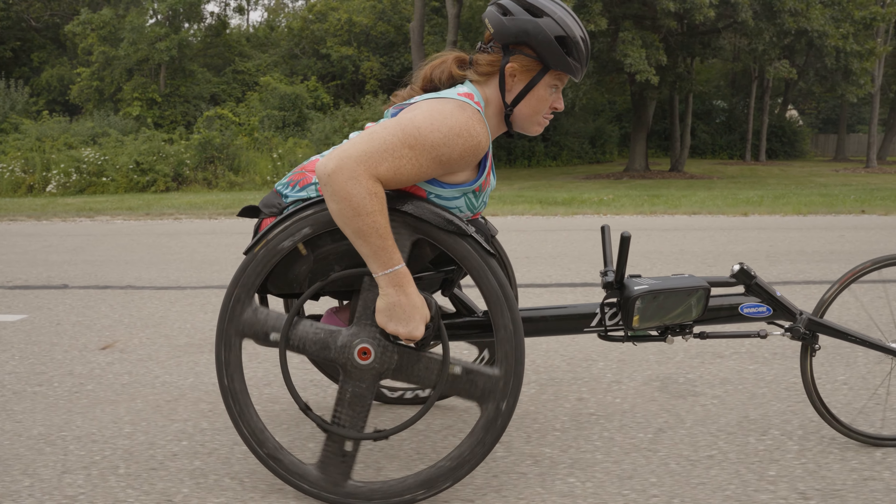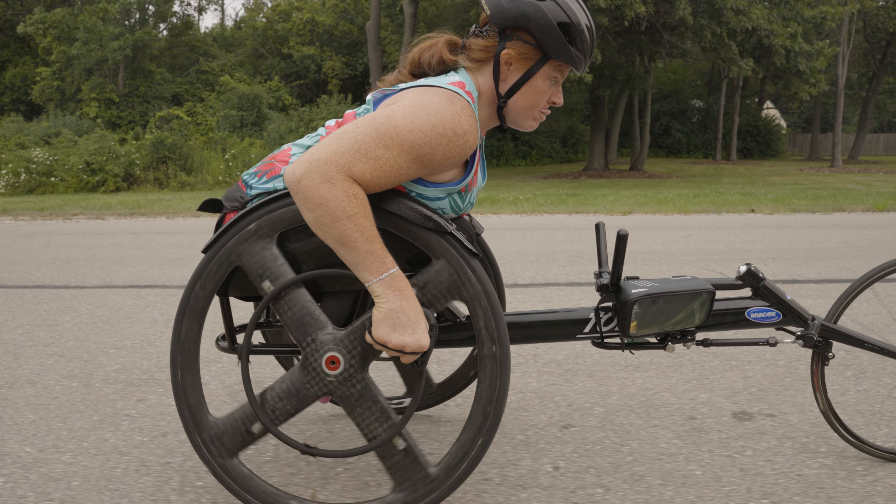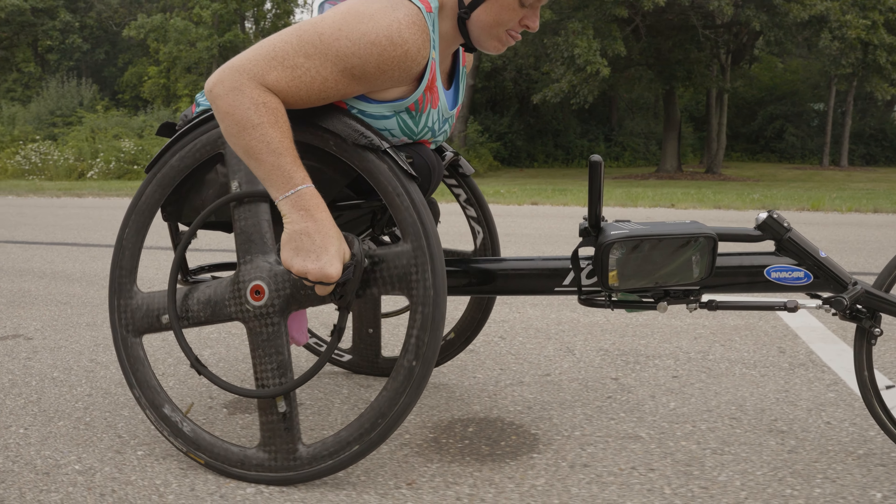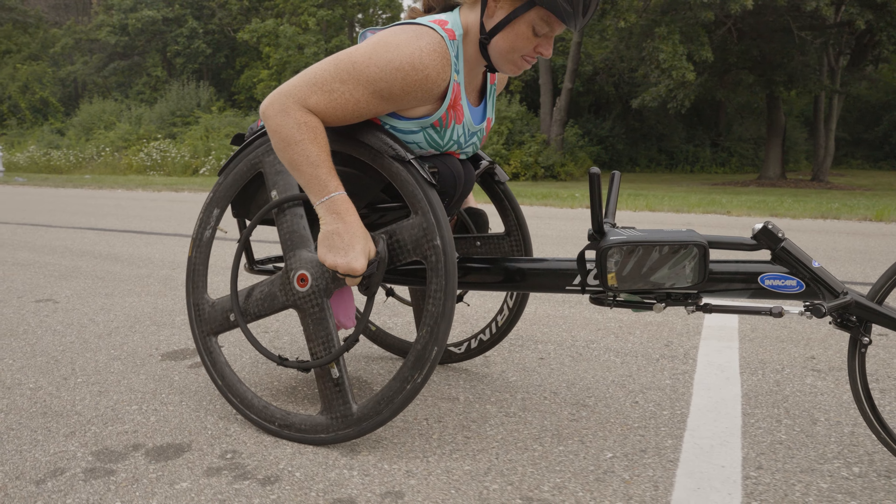To stop your racing chair, practice your deceleration process. I recommend using your wheelchair racing gloves to apply pressure on the push rims in the opposite direction, enabling you to slow down gradually.